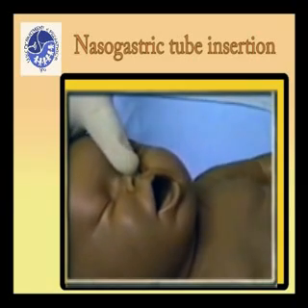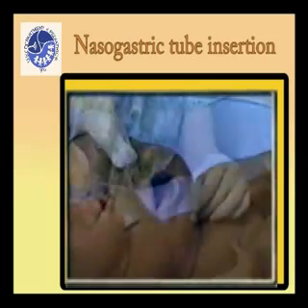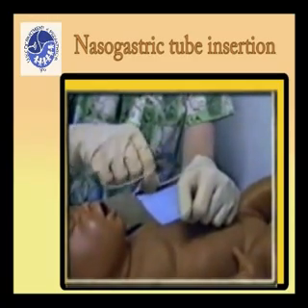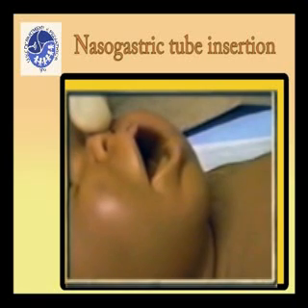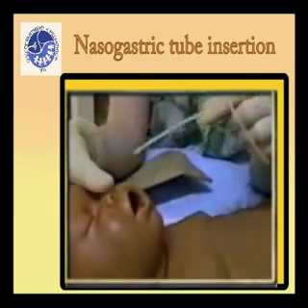Examine the nasal passage and select the largest site. Grasp the tube about 5 to 8 centimeters from the terminal tip. When ready for use, dip the tip in water-soluble lubricant. The tip of the nose is pressed upward with the operator's free thumb. This enlarges the external nasal opening.